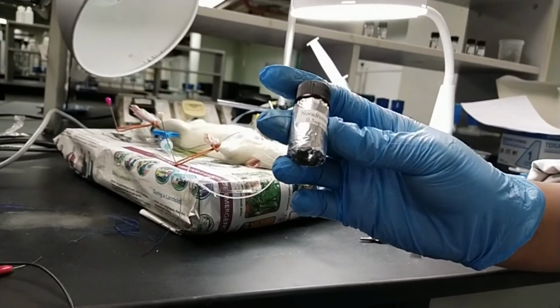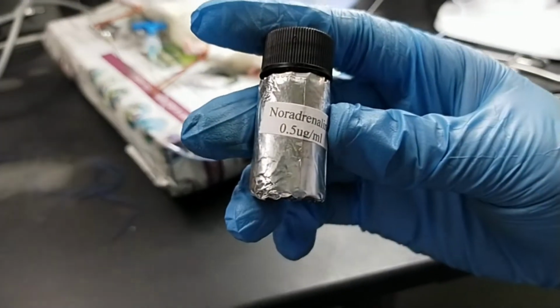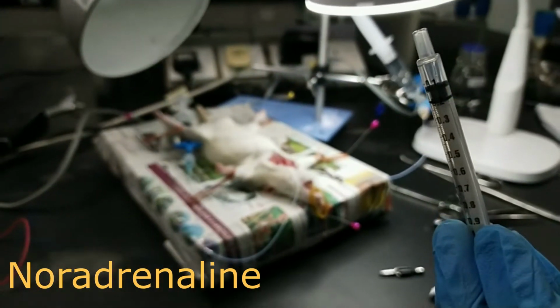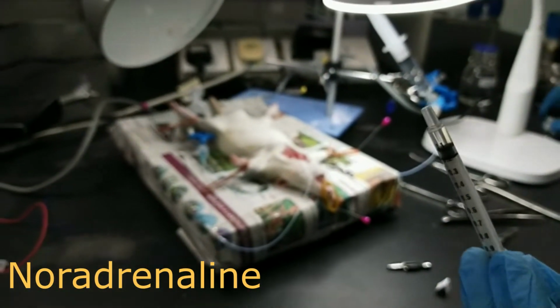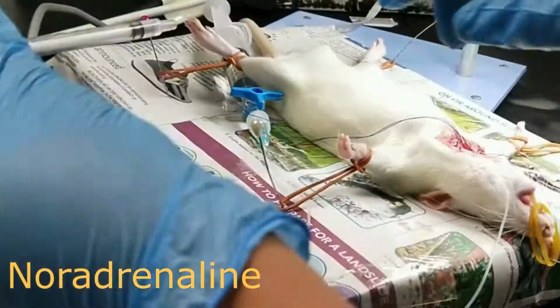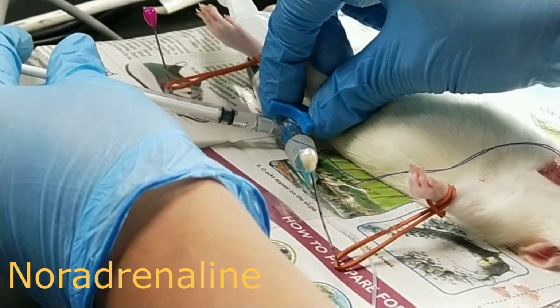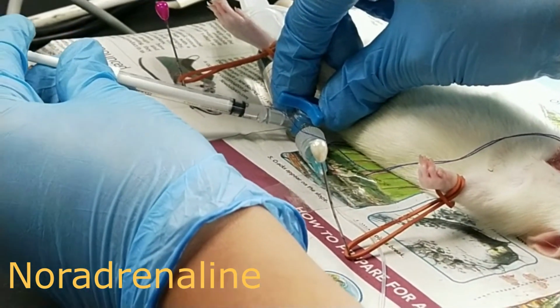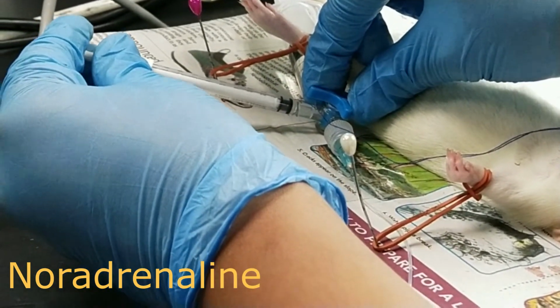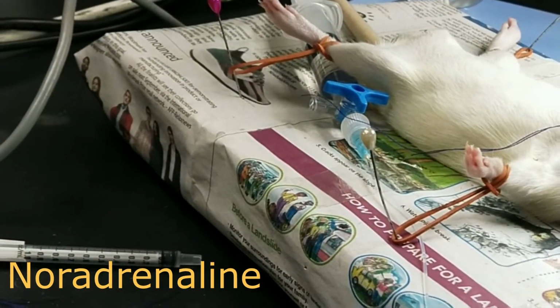So next we're going to proceed with noradrenaline, 0.5 microgram per ml. Based on the calculations, we need to inject 0.1 ml of noradrenaline into the system. So we're going to proceed for the injection now. You need to slowly inject the NA into the system, followed by 0.5 ml of normal saline.